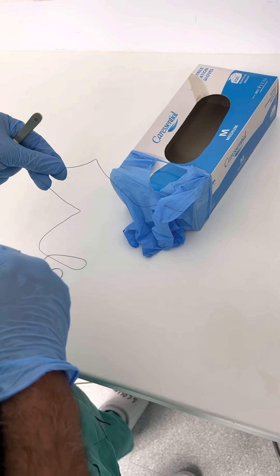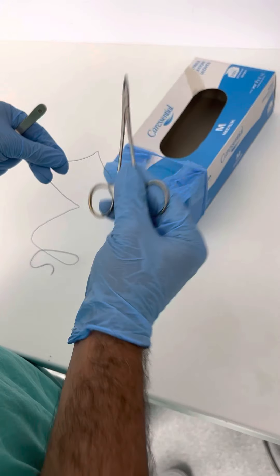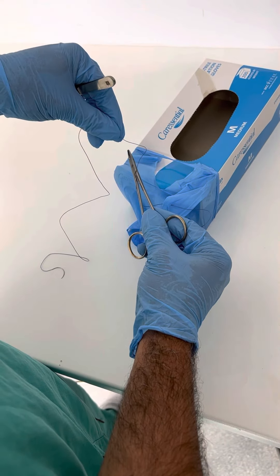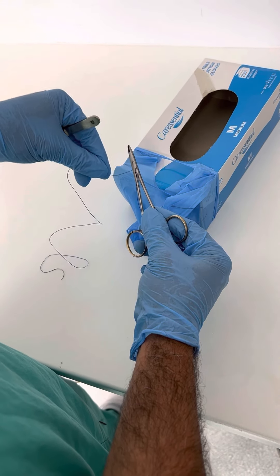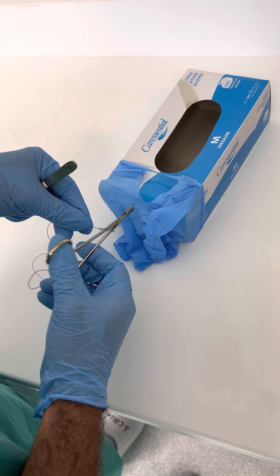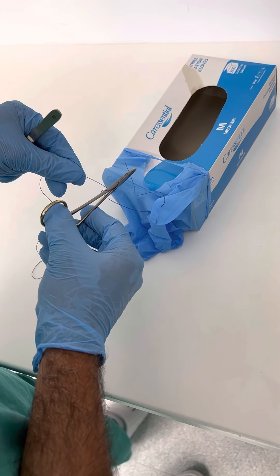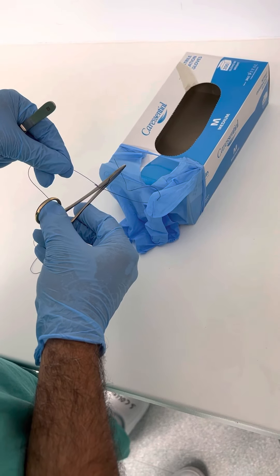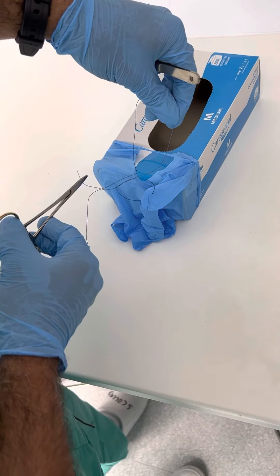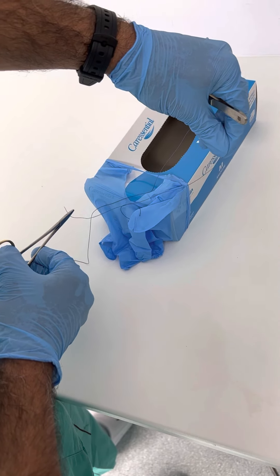My left hand — I'm right-handed — so my left hand is on the left side and the instrument is in the middle. I'm going to do my first throw like this and stay on the left. Then I'm going to grab the thread there. My left hand now is going to move to the right like this. Can you see that knot there? It's sitting nicely.